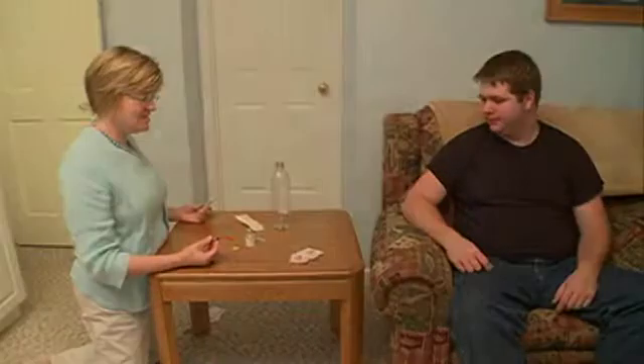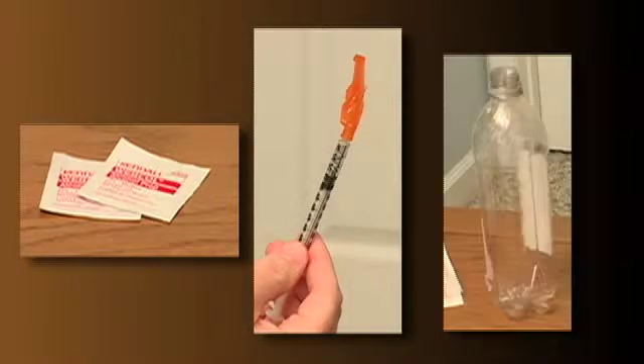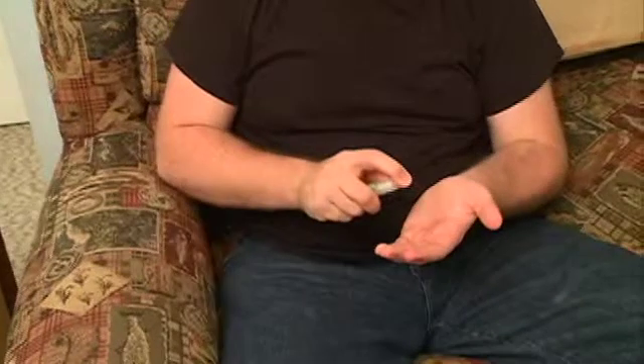Gather your equipment. You'll need alcohol pads, the syringe with the medication already drawn up, and a plastic container to dispose of the used syringe and needle. Complete your hand hygiene.